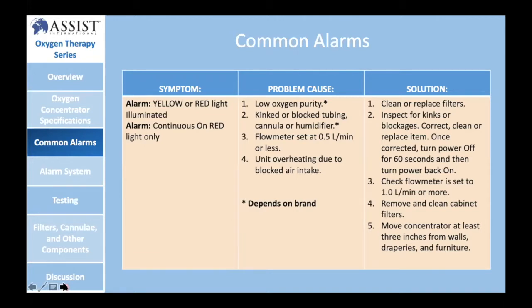And then make sure that your concentrator is at least 3 inches away from the walls, draperies, or furniture to ensure that there is adequate flow of ambient air into the oxygen concentrator when it's turned on.